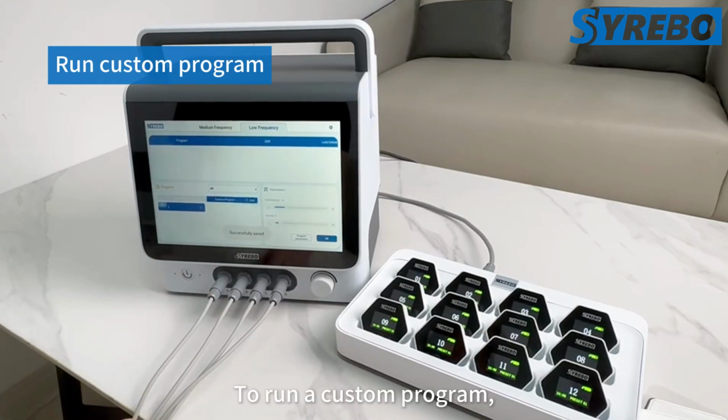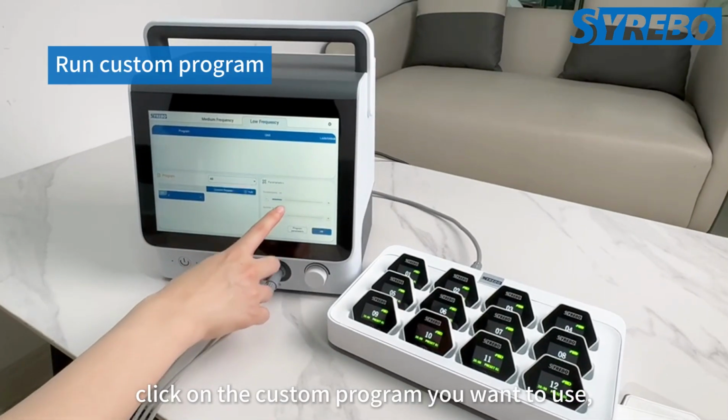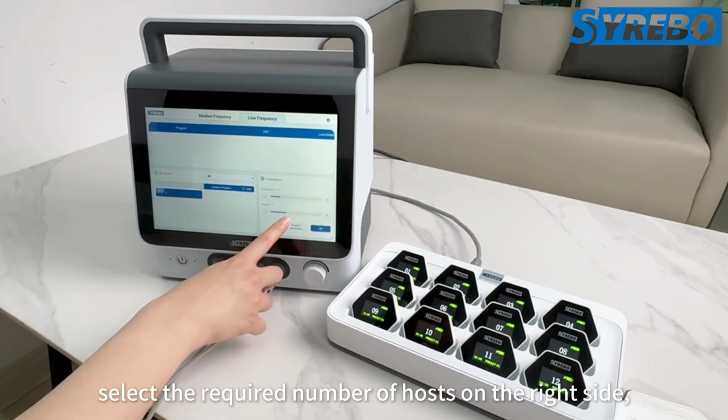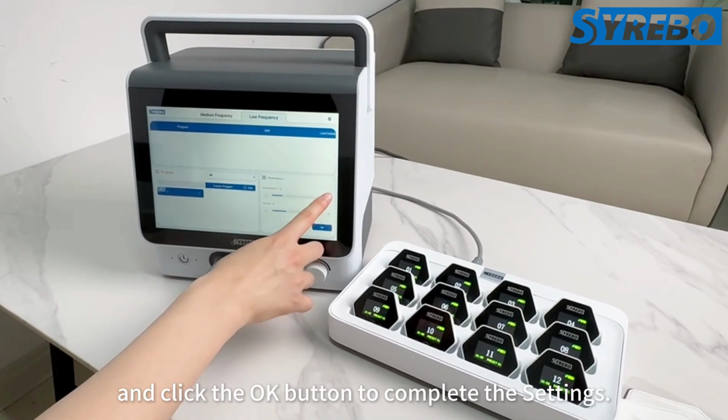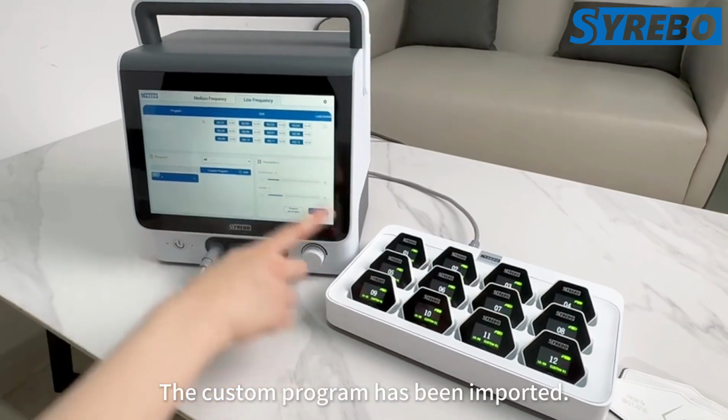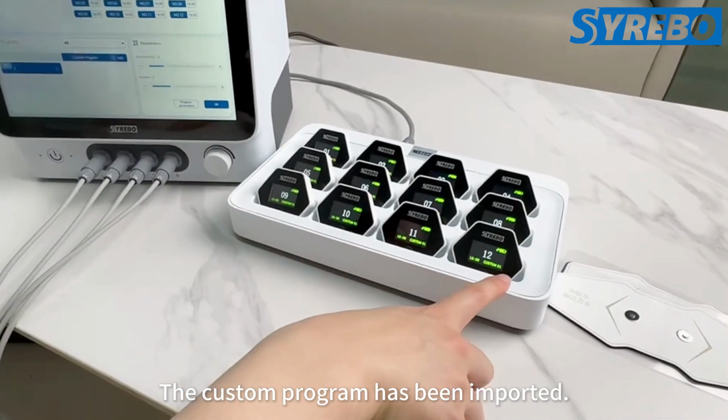To run a custom program, click on the custom program you want to use. Select the required number of hosts on the right side, and click the OK button to complete the settings. The custom program has been imported.